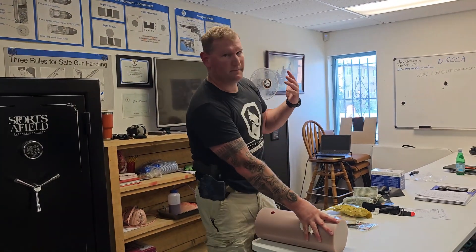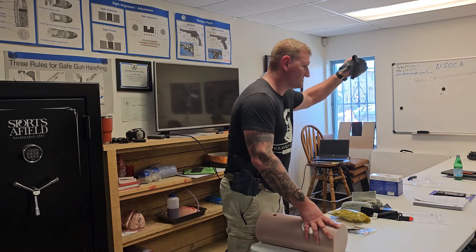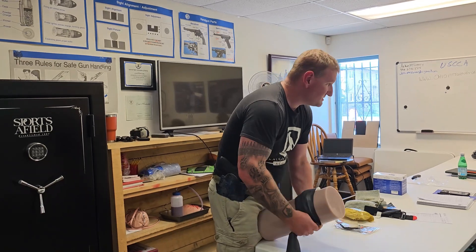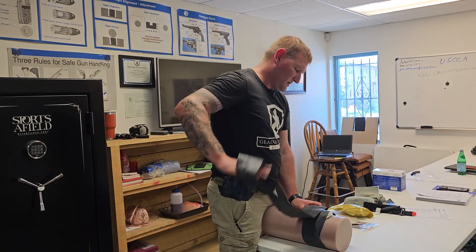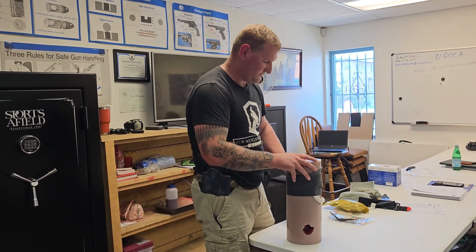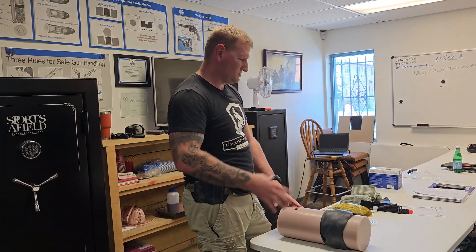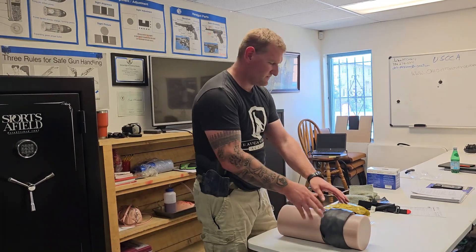What about all this remaining material? This goes on top, and then we're going to apply pressure. Here's the SWAT-T coming into play. We can take this and use it as a pressure bandage — it's not a tourniquet, it's a bandage. We put this on, wrap all the way to the end, then tuck it, and we can move on to somebody else or this person is ready to be transported with EMS.